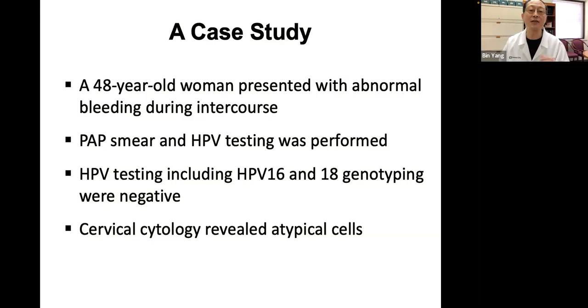But in those cases, you have to consider them individually, like the case I presented, where you have the background. That was a 26-year-old. She already had three years of Paps consistently read as LSIL. Now I see probably less than 5% of those cells with higher N/C ratio. They were individualized, and individual high N/C cells in that background push me to call ASC-H. Unfortunately, we don't use that anymore.